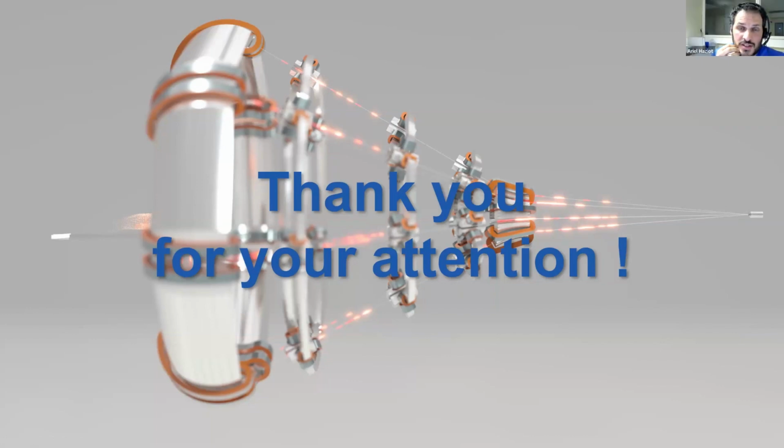Yes. So the first design that I showed, the compact proton design, is part of the thesis from Enrico Felcini, who is now working at CNAO. And he showed in his thesis that we are reaching the clinical requirement. So we are within the 1 millimeter, and we can even do painting at a more accurate precision. So we know that we can design a field that is appropriate to those limits.